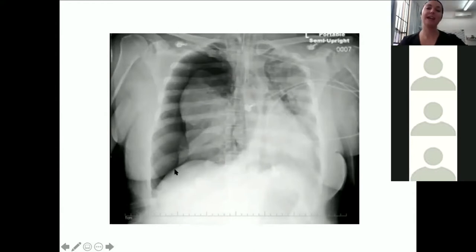There we go. So can you see that you've got the lung collapse down here? Here's the lining of your lung. Your right lung is collapsed down, typical pneumothorax. You've got no lung markings between the lung and the chest wall. Trachea, really difficult to see exactly where the trachea is. To be honest, I can't quite work out what's going on.